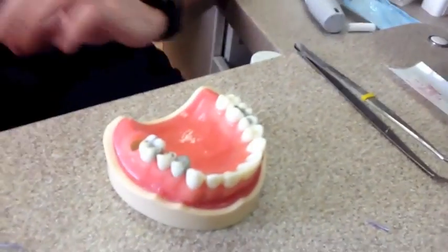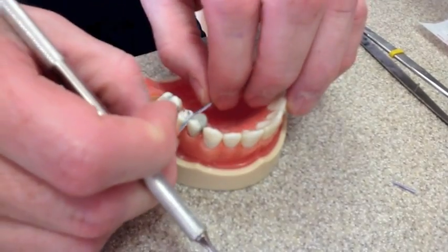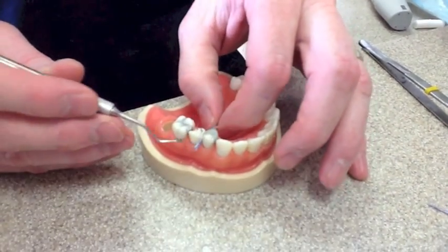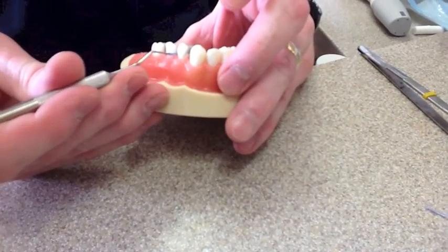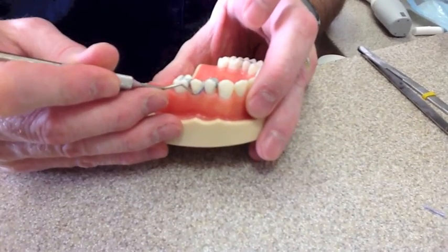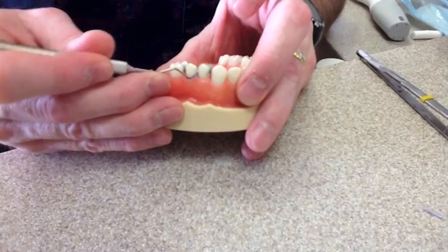Okay? So now when we've done that one, we're going to go ahead and take the blue cord, and we're going to put it in. I'm actually going to kind of put it between the teeth. And I'm going to pull it tight because on this typodont it's hard. And we're going to come in there. I'm just going to push it. See how I've pushed it in? I'm just kind of holding it there. See how it stayed after I held it? Push it and hold it, and it'll stay.